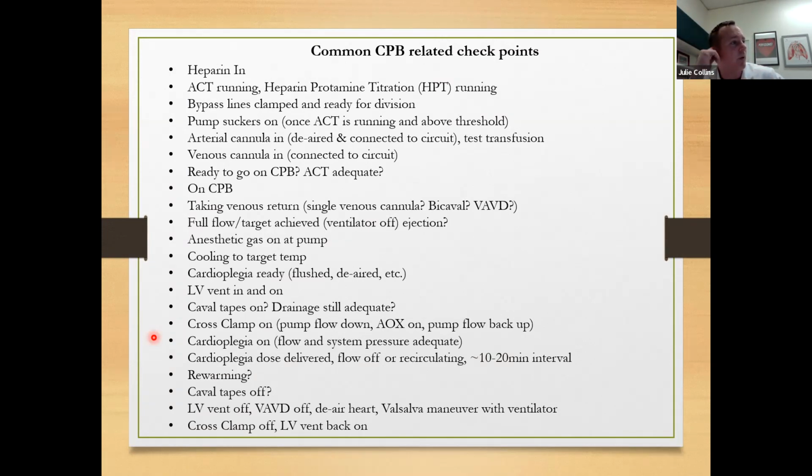So I want you to always think of that order when you're doing your SIMS, when you're observing cases, and ultimately when you're pumping cases. And in terms of situational awareness, I want you to really establish: where have I been? Where am I at? Where am I going? Those are the 3 questions I always want you to be able to answer, or attempt to answer, when you're on bypass.